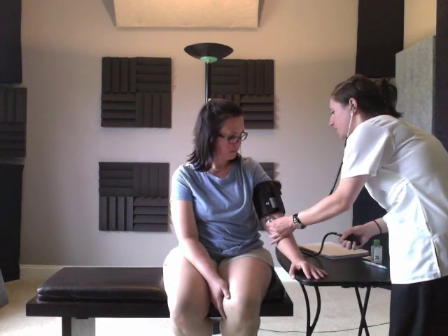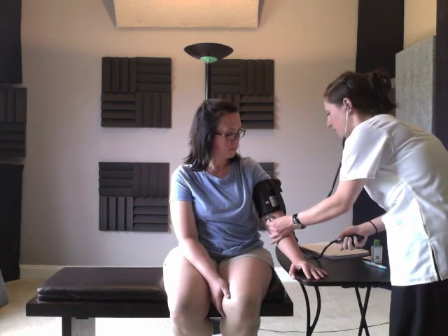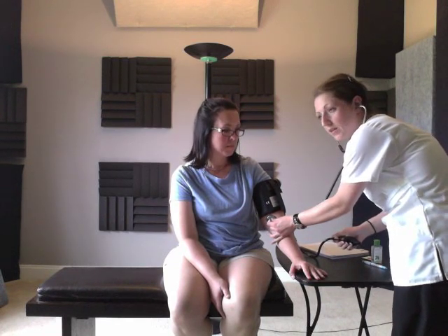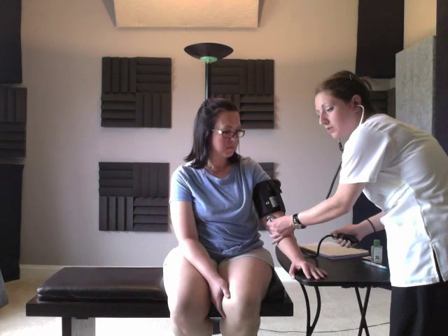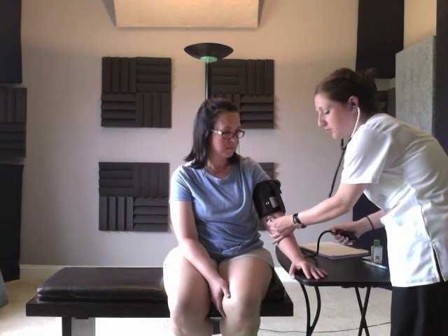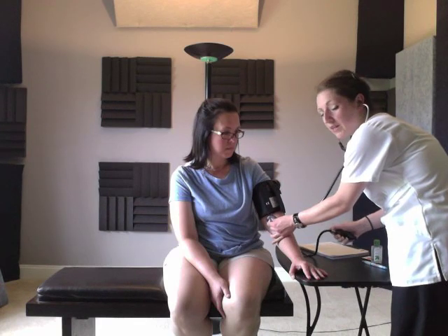Once you reach the maximum range for your patient, slowly and completely deflate the cuff. The first beat that you hear upon auscultation will represent the systolic blood pressure. The number at which this beat disappears will represent your diastolic blood pressure.